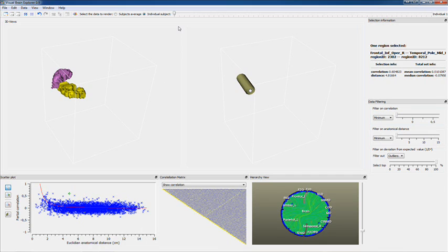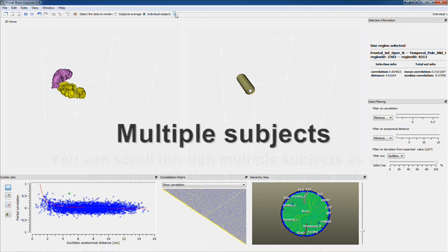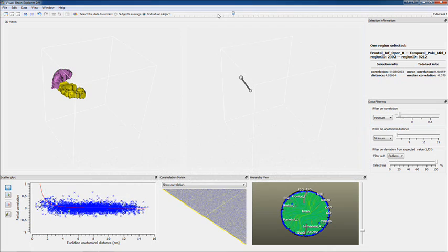What you see is that in the information, you can see its correlation is 0.6, while the average correlation for this link is 0.01. So I expect to see that when you scroll through the individual subjects.